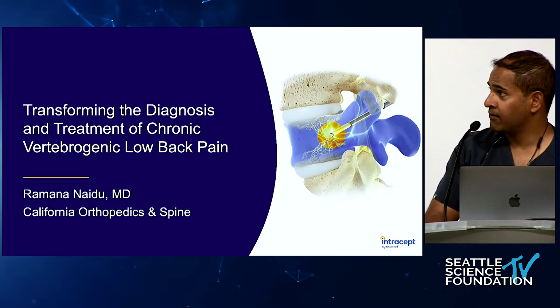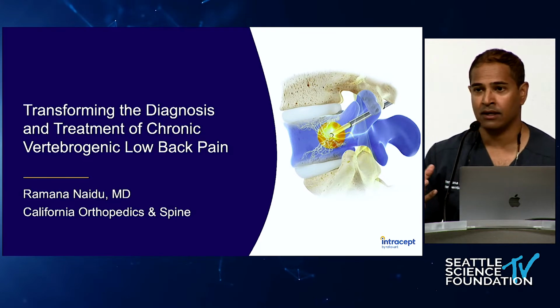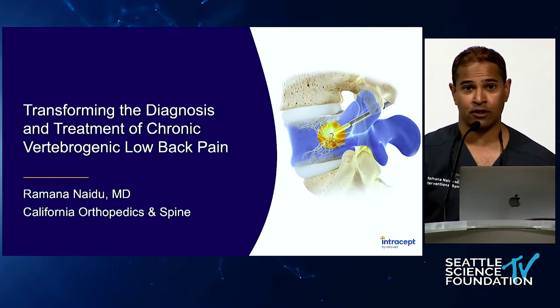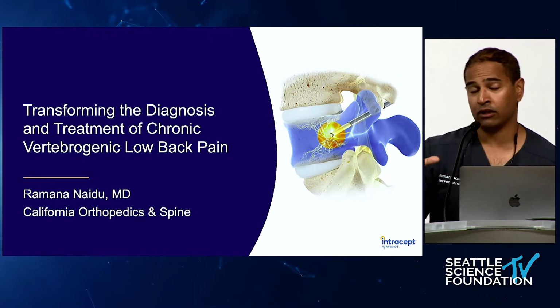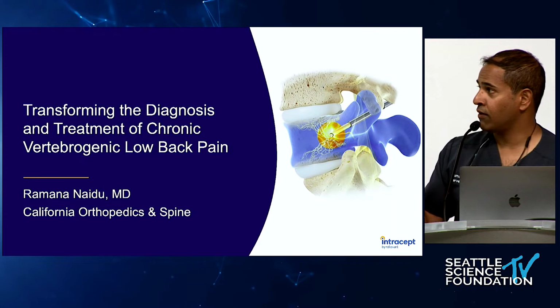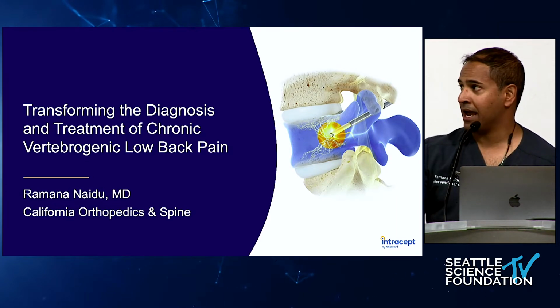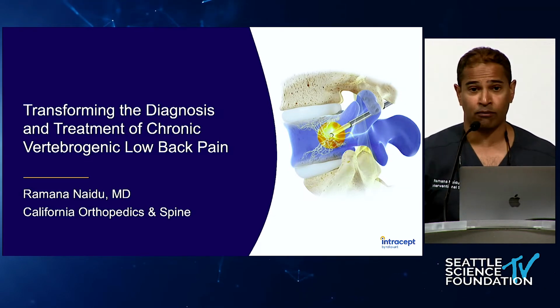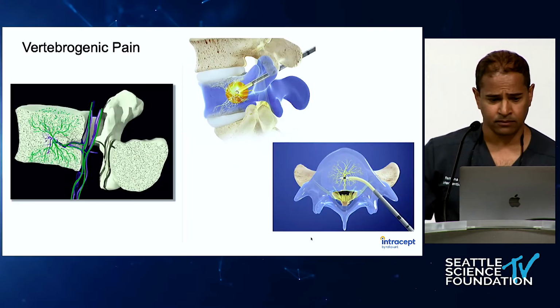So this is the term vertebrogenic pain. That's where it comes from, to differentiate to some degree from discogenic pain, which historically has had some faults and failures. And that's the approach the company has taken. And I applaud them in looking at the end plates, the nerve, rather than just the disc itself. But I think the future is going to really pan out as far as where this therapy and the intradiscal therapies pan out. And I think there's a role for both, frankly. I don't think this is going to obviate all intradiscal therapies by any means.